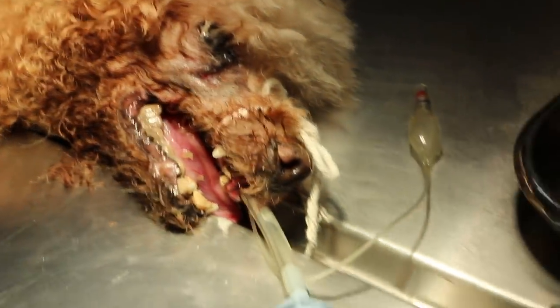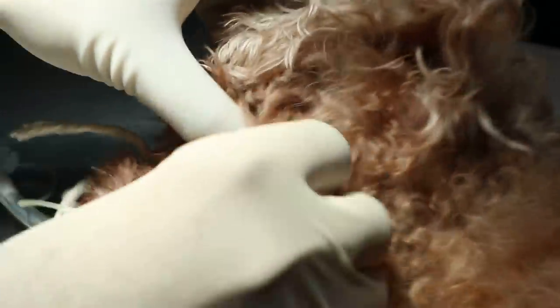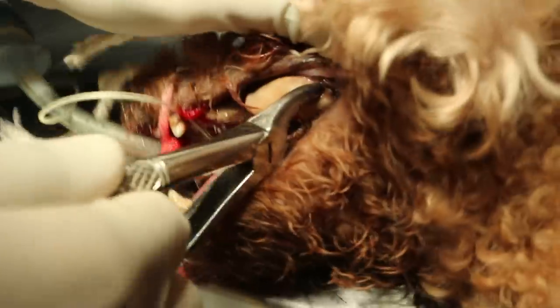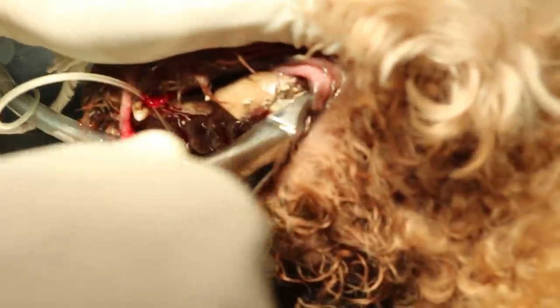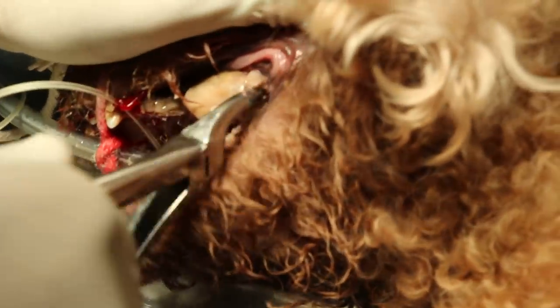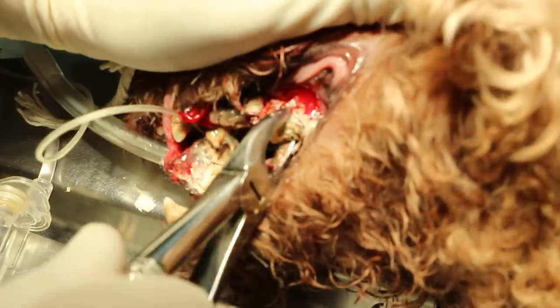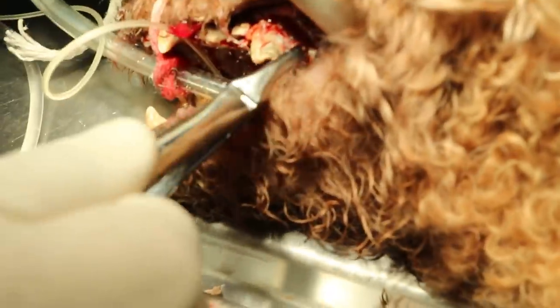We look at the premolar first. We look at the premolar again — ready to write down. There's a very strong smell of bad breath here. This one is probably very hard tartar and periodontal disease stage 4. This is probably premolar, and this is molar 1. Premolar 4 should be this one. Crack the tartar — you can see it. If premolar 4 is strong then we don't extract. It looks strong — test it then.